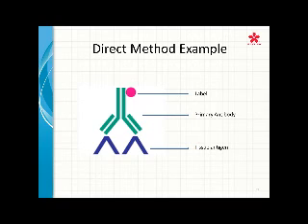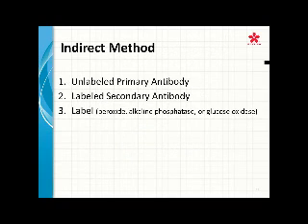So we're going to go on to the indirect method. If you look at the steps in this method, you can see that something's been added. You can now see the primary and secondary antibodies that we went over in the definitions, going through the rest of the detection system. The indirect method is a really simple modification of the direct method. So again, I'm going to go through the steps just so everyone can keep in mind how this happens. Always deparaffinize your slides.